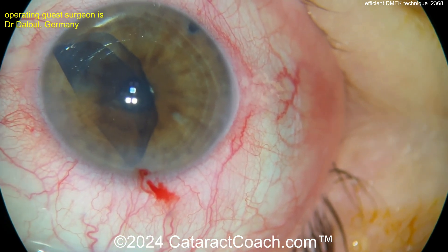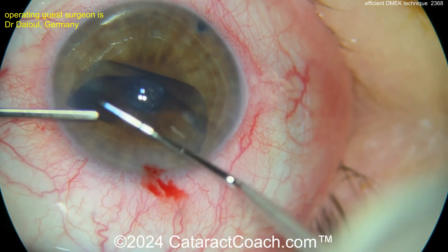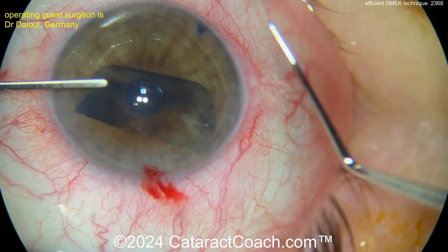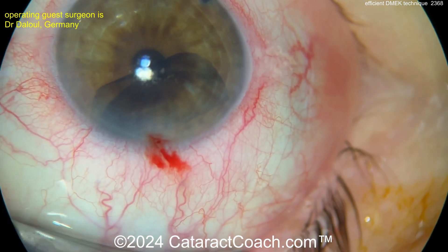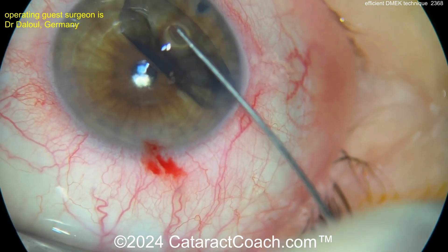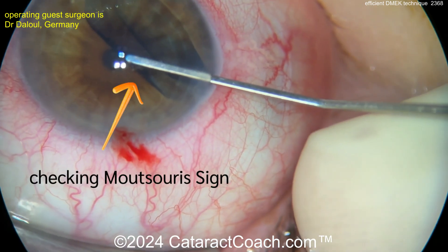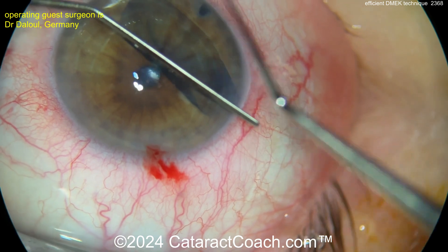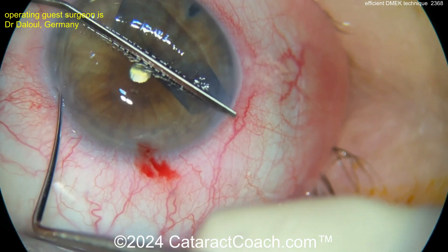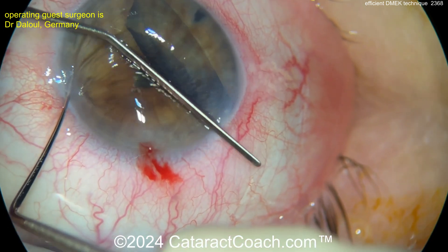Now, how do you unfold it? There are many techniques for understanding the origami of the way it's folded. The best videos I've found were from Martin Derasimer and also from Peter Veldman, and all those videos are on CataractCoach. Don't over-inflate it because it can come right out your incision. Once you take your time and get it inflated to the appropriate size, once it's going to be fully unrolled, just replace an air bubble inside the eye, and it flattens out pretty nicely.